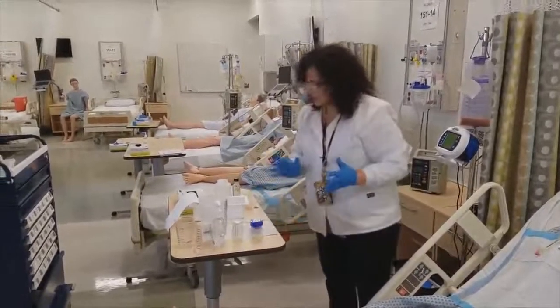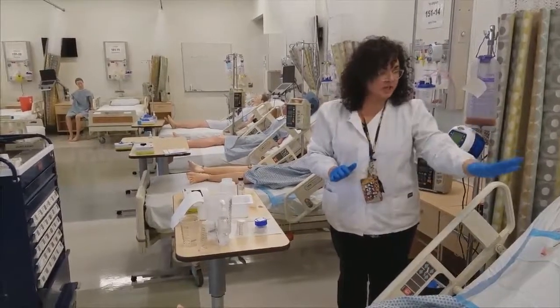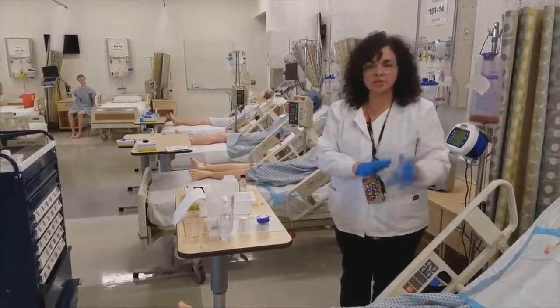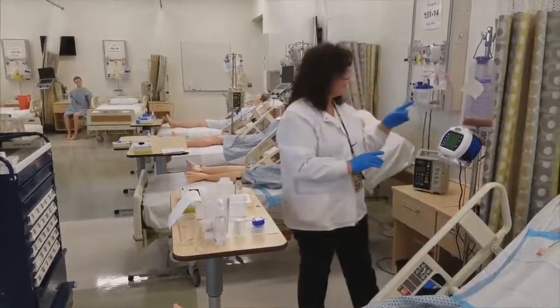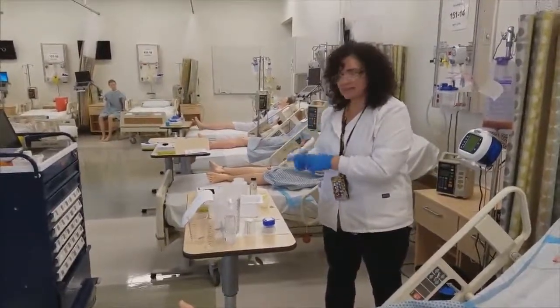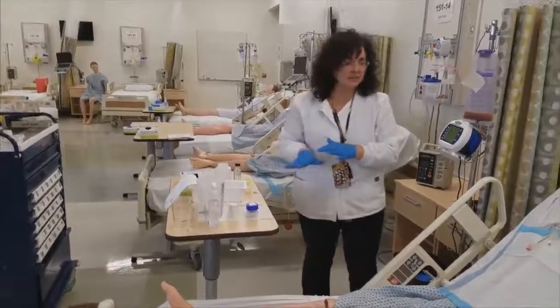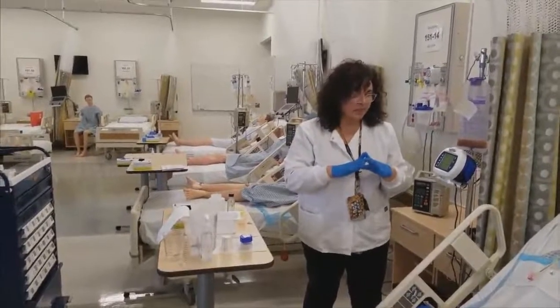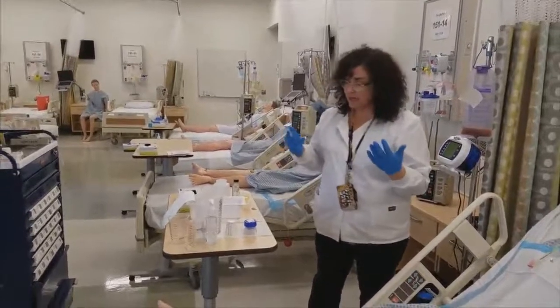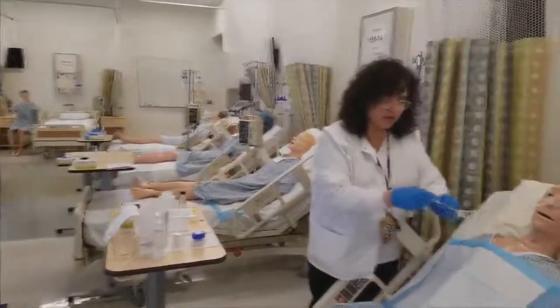All right, so moment of pause. Make sure that I have done all of my safety checks and balances. I checked the position of the tube. I checked GRV. I gave the GRV back. I followed with flush. I checked patient identifiers. I confirmed allergies. I checked each medication against the EMAR 3 times, and I scanned them all in. I also scanned the wristband. I thought about pre-administration assessments, and I also know that there was no problem in crushing these meds. So with that, I'm ready to go ahead and proceed. So all of the prep is done. I can focus on administration.